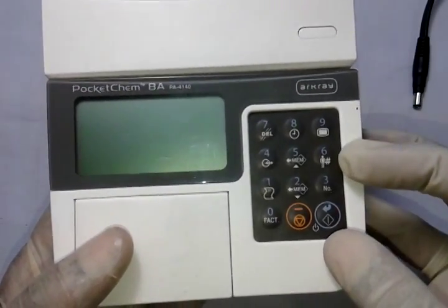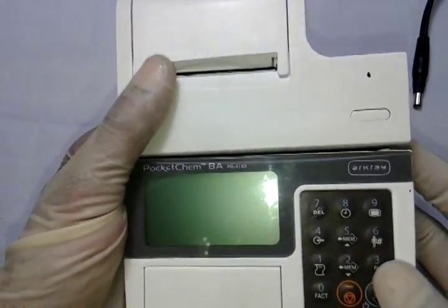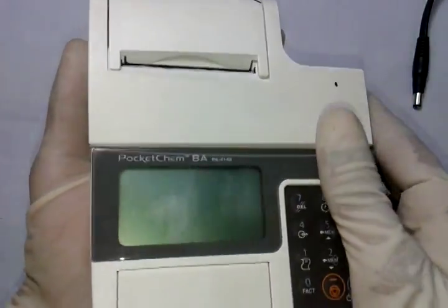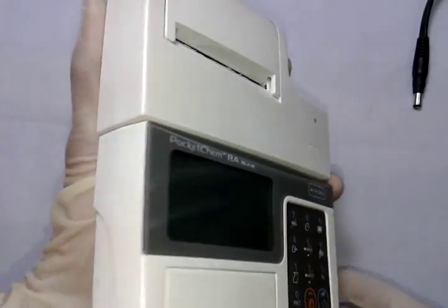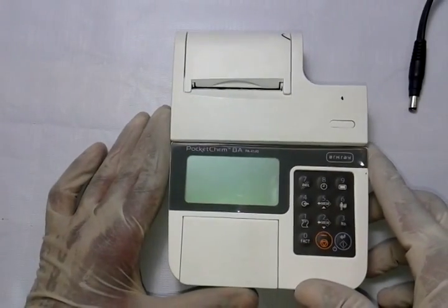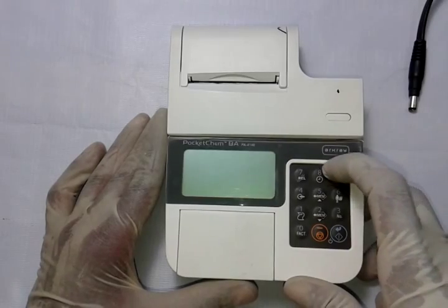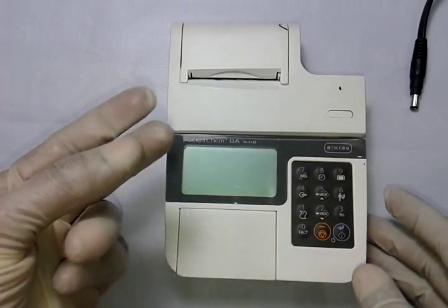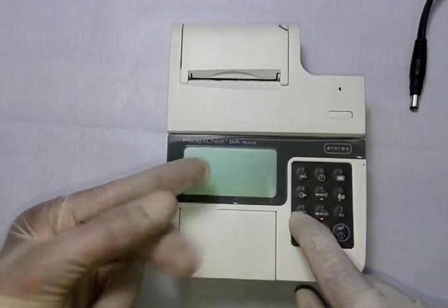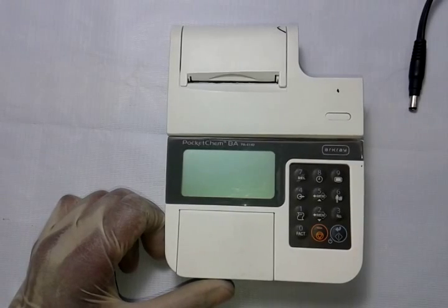This instrument has a simple keypad — easy to operate, easy to carry because it's very small, compact, lightweight, and portable. You can easily carry it to the patient bedside, take a finger prick sample, and perform a blood ammonia test within three minutes and 20 seconds.